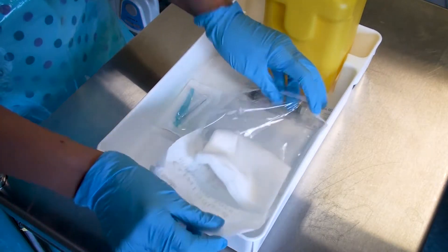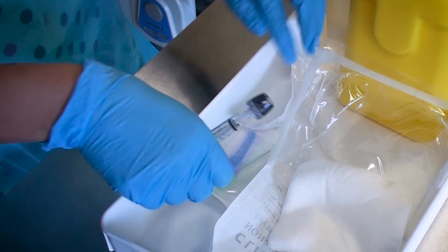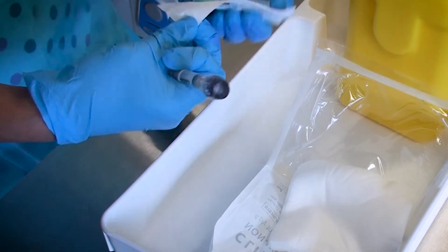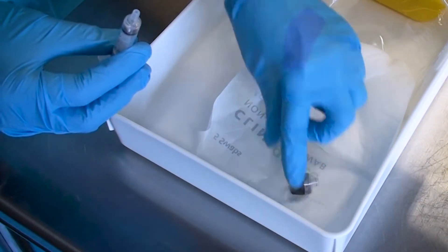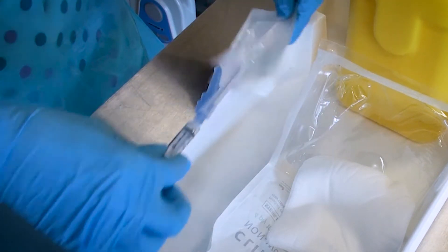Then prepare all your equipment, opening the gauze, placing the needle onto the ABG syringe, and ensuring that the top of the syringe is not discarded, as this will be needed later for processing the sample.